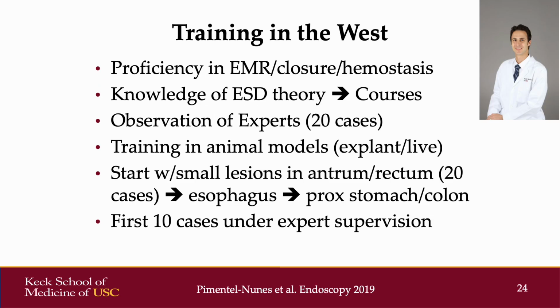Training in ESD can also be successfully achieved in the West. It is very useful to initially gain proficiency in EMR and closure and hemostasis to really understand the fundamentals. Then knowledge of ESD theory can be acquired through attending different courses, and it is very important to observe experts performing ESD, generally at least 20 cases, as well as training in animal models, both explant and live models, to gain experience with controlling bleeding and hemostasis.